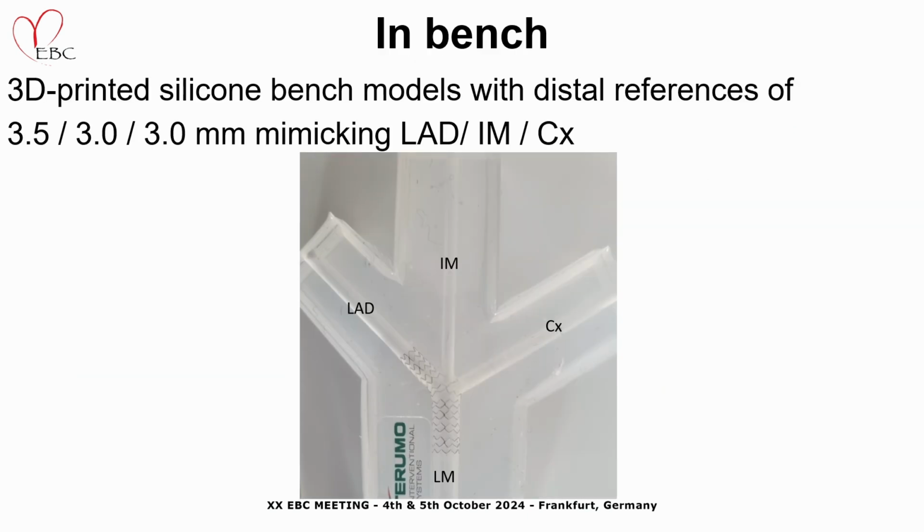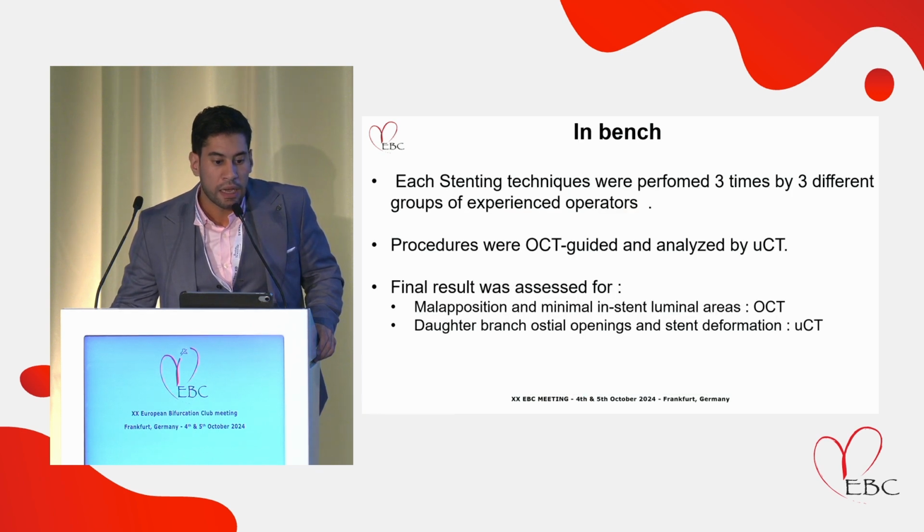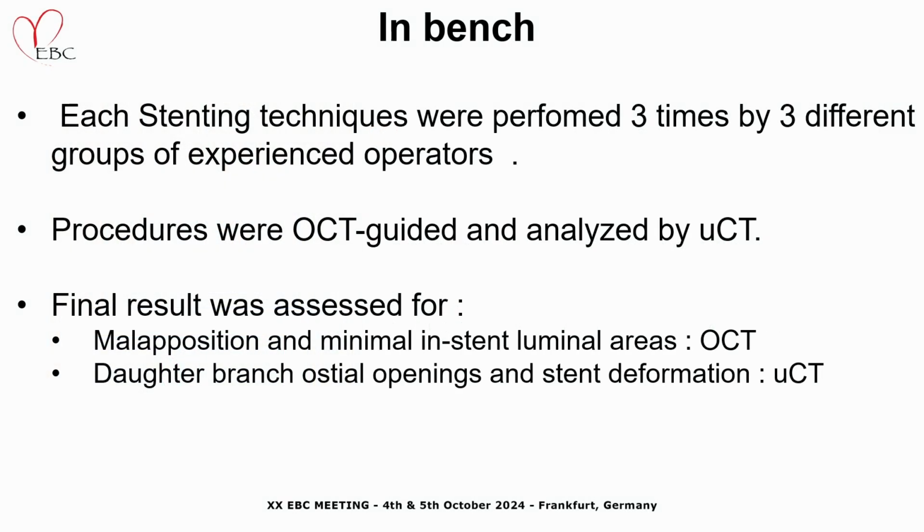So for that, we performed an in-bench testing using 3D printed silicon bench models with distal reference of 3.5, 3.0, 3.0 mimicking LAD, intermediate and circ, and the left main was 5.0. We tried to adapt bifurcation stenting techniques to the trifurcation configuration. Each stenting technique was performed by 3 different groups of experienced operators. All the procedures were OCT guided and analyzed by micro-CT. Unfortunately, the results of the OCT analysis are not done yet, so I cannot share that with you today.